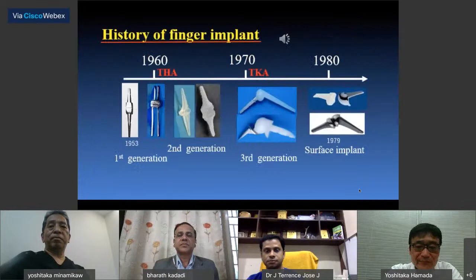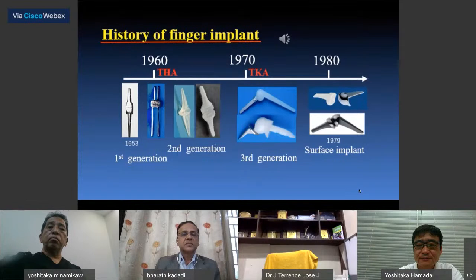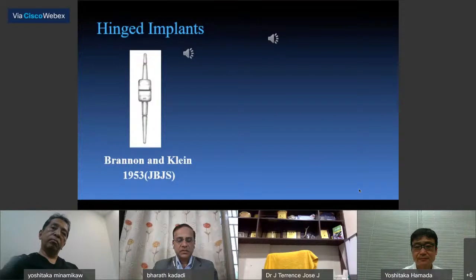This figure shows the beginning of the finger implant in its early phase. The hinged implant was introduced as early as 1953, which was 20 years earlier than total knee arthroplasty and 10 years earlier than total hip arthroplasty. A single stem metal implant by Brannon and Klein was used for 10 surgeries without bone cement. However, early implant loosening and breakage were found.